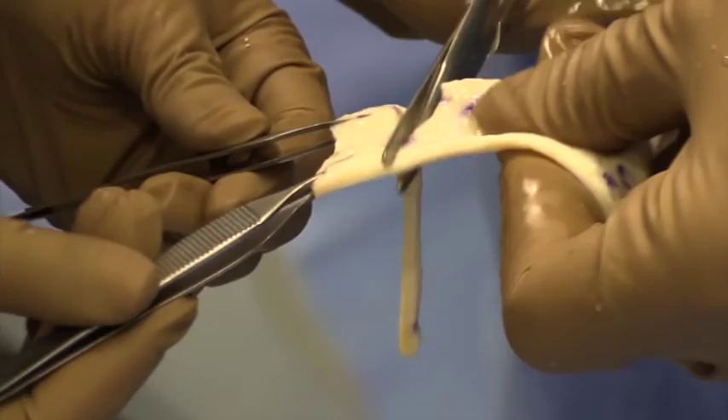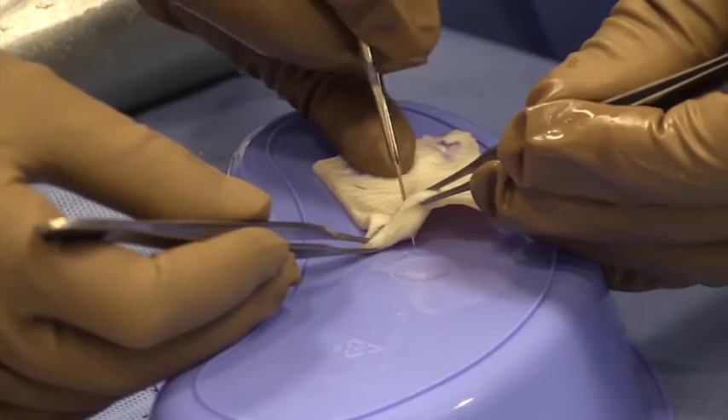The graft was then properly shaped, and 4 piercing holes were placed along what would be the medially placed portion of the graft.